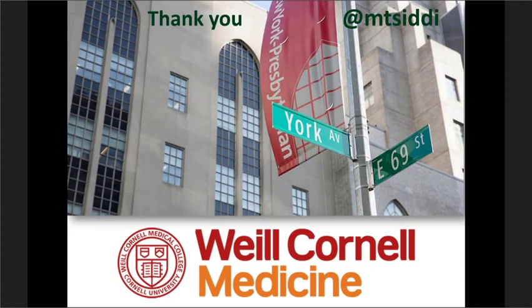Absolutely. I think one thing definitely correlates with the other, and the more material one has, the better it is for the patient outcome. It's a one-step process when you go to collect the specimen. I mean, for adequacy assessment, the FNA followed by concurrent biopsy.